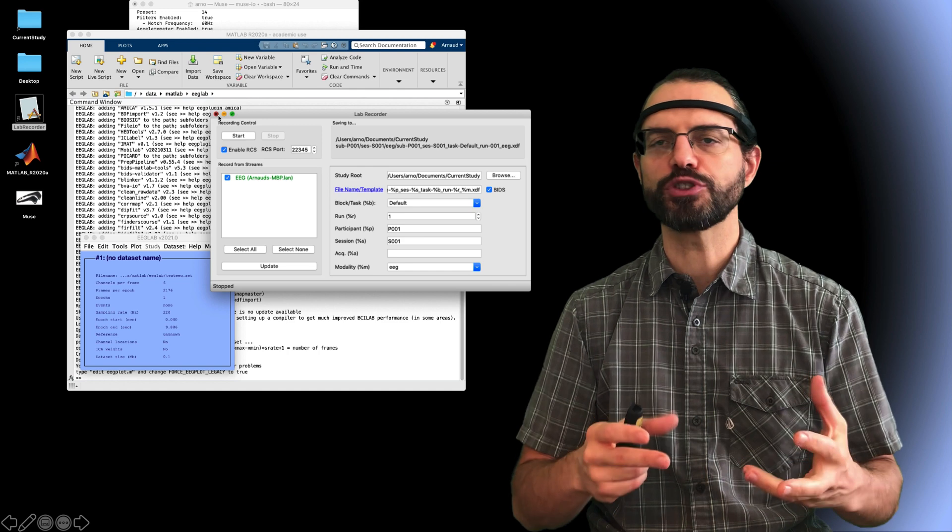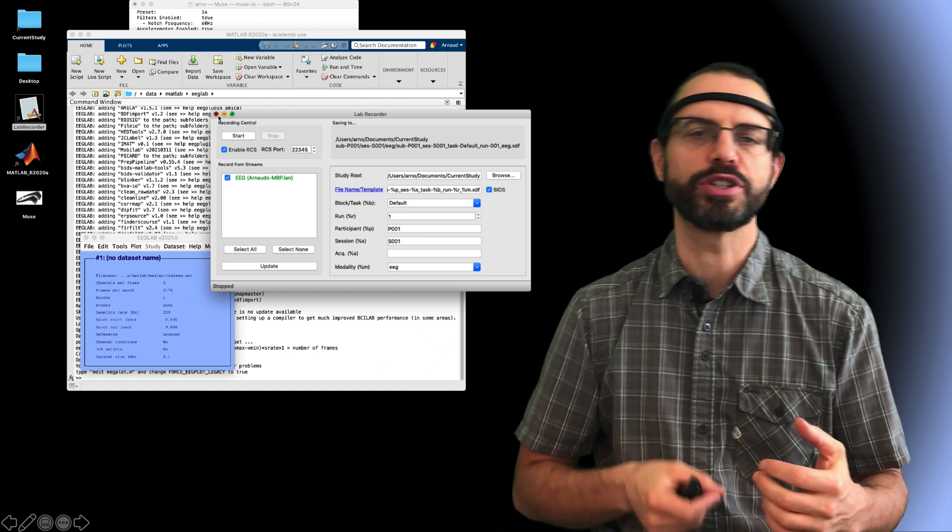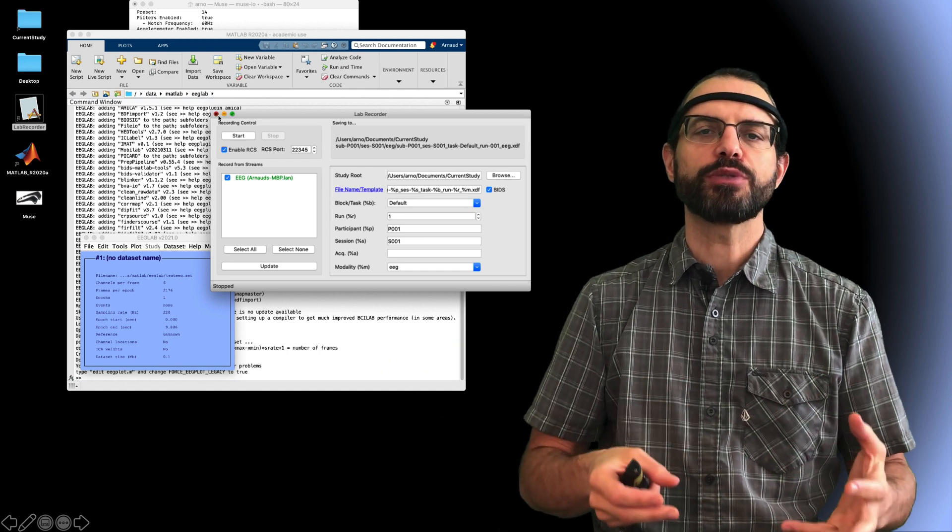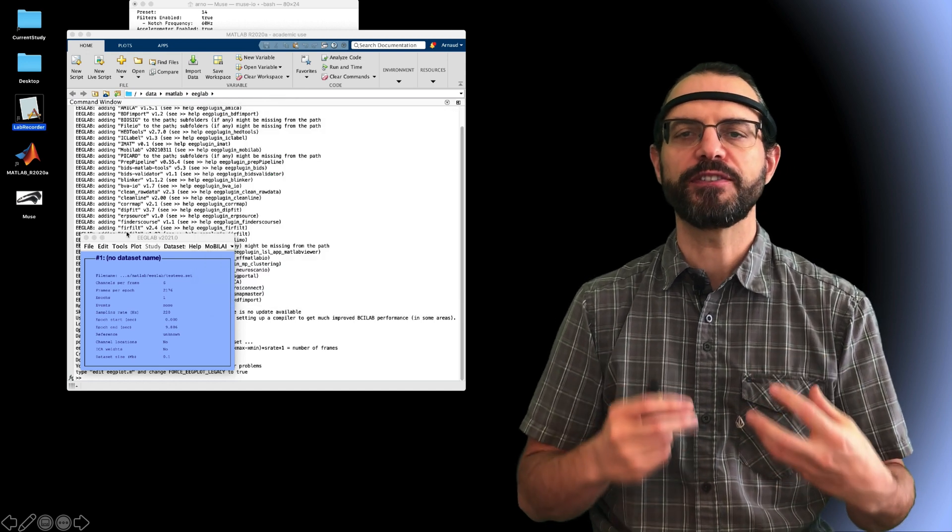Also, I'm using the Mac version, but there is a Windows and a Linux version. Now, I'm stopping the data acquisition. This saves the data as a file in the XDF format.